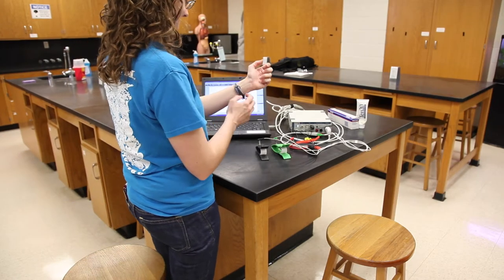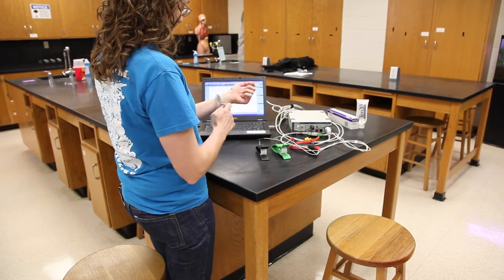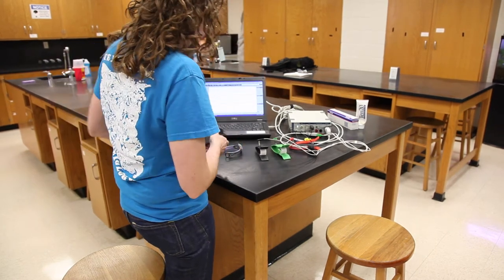Have the subject remove any jewelry, watches, or battery-operated devices. Then have them take a seat.